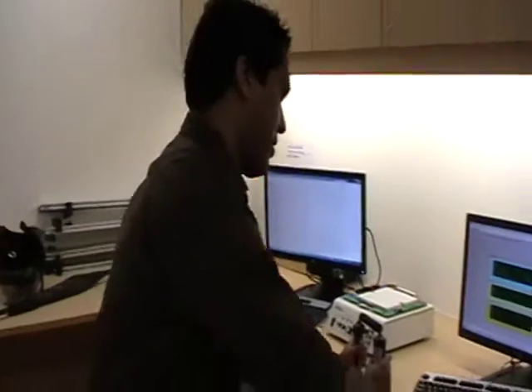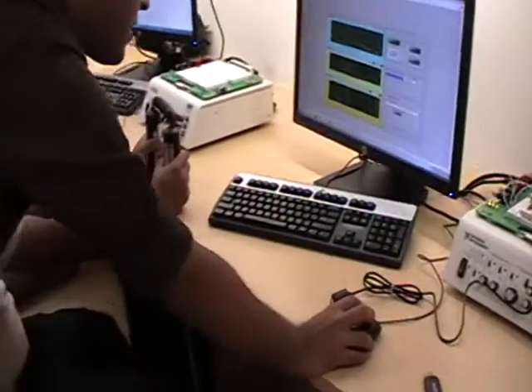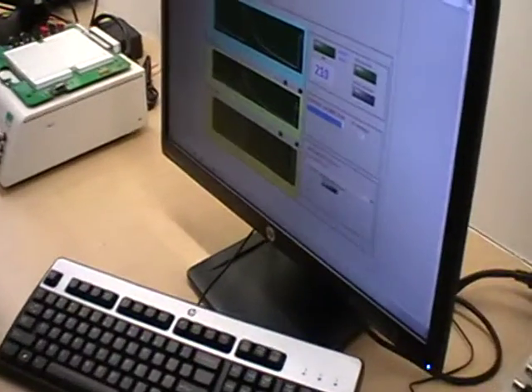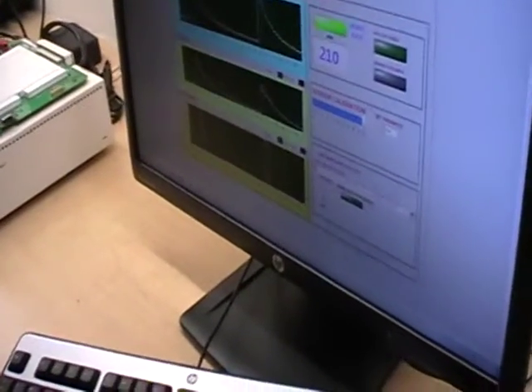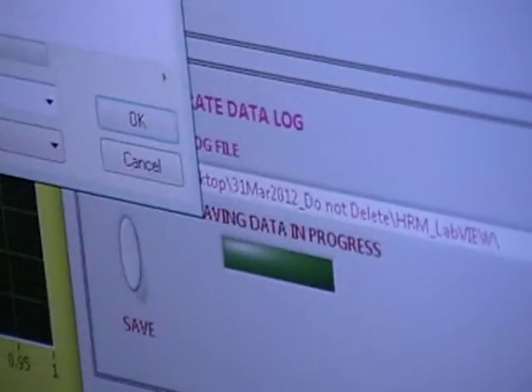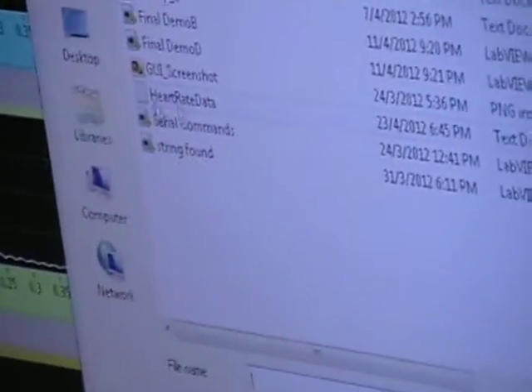So you can see that it is saved in this particular folder. So whenever the system runs, this file will keep getting updated. So you can basically choose which file we need to save the heart rate data to. So in this case, I'm saving to this heart rate data.